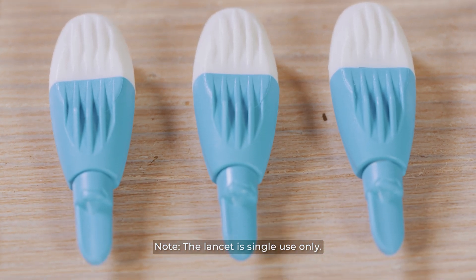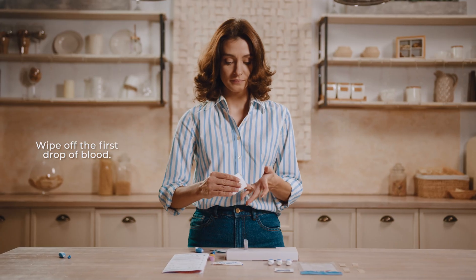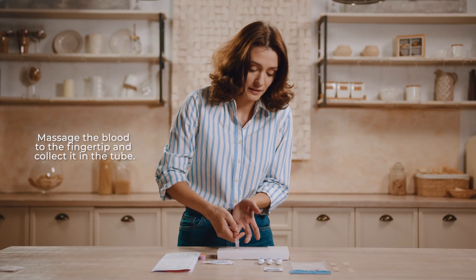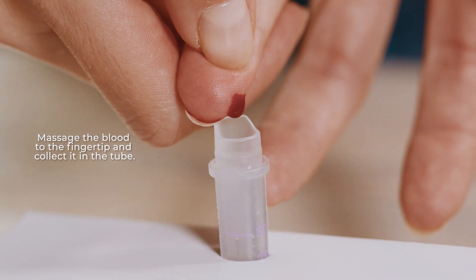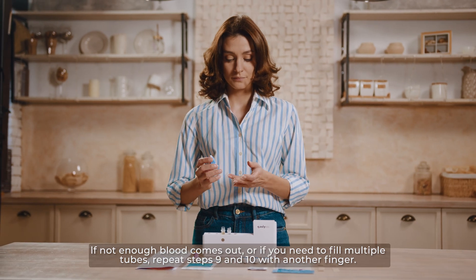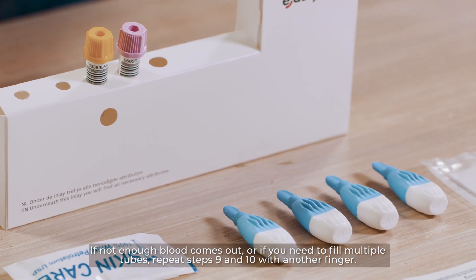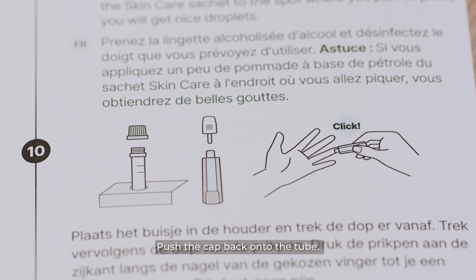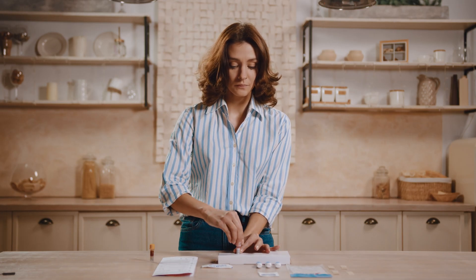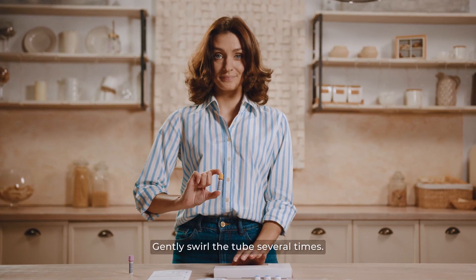Note: the lancet is single use only. Wipe off the first drop of blood. Massage the blood to the fingertip and collect it in the tube. Fill the tube to the top mark. If not enough blood comes out, or if you need to fill multiple tubes, repeat steps 9 and 10 with another finger. Push the cap back onto the tube and gently swirl the tube several times.